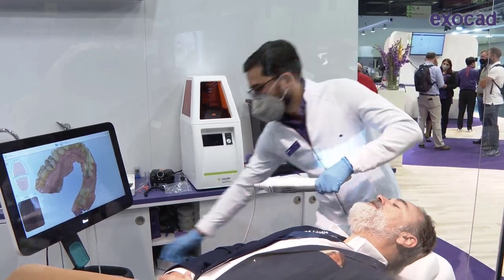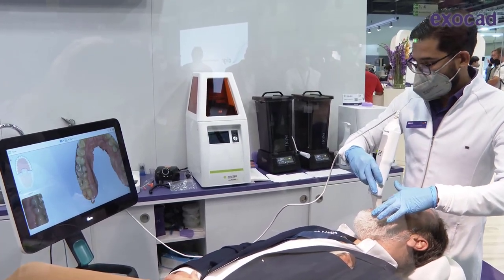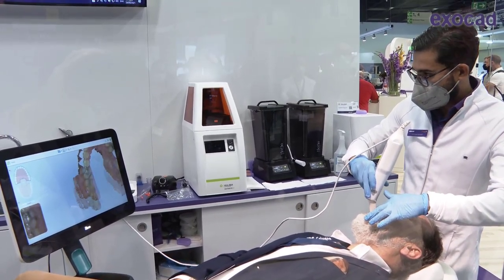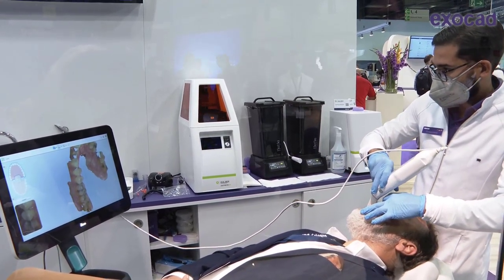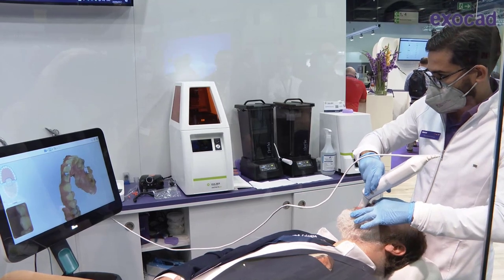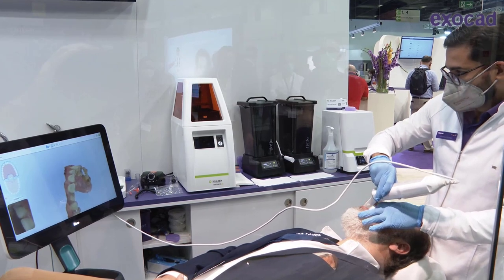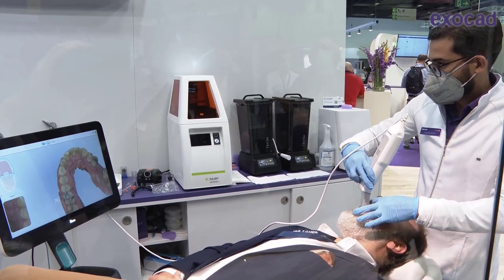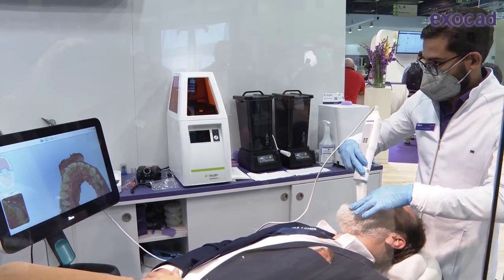As you can see, we're reaching the distals quite nicely. If there's a missing tooth or gap, due to the shape and size of the lens we can cover a very wide area, requiring fewer passes. Now we're finishing up the upper arch on the buccal right, scanning from back to front. We are in contact with the tooth, and that's pretty much all — we have a little gap on the mesial of tooth number seven which we can cover quite easily.